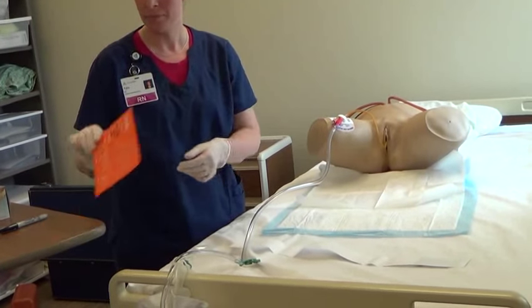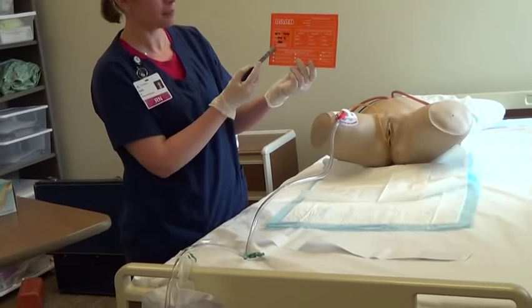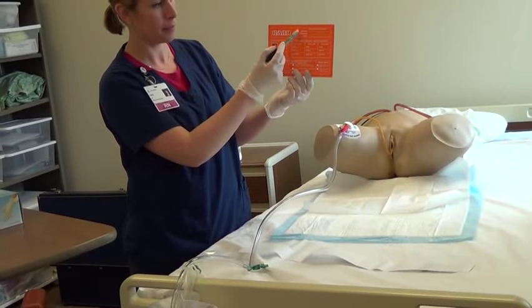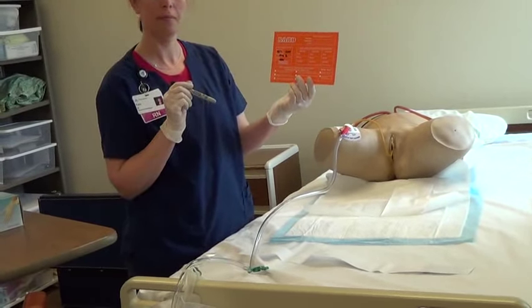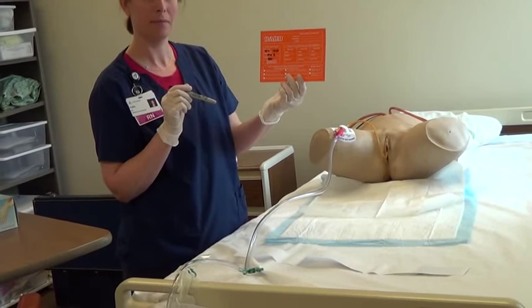Complete the orange stickers. One goes on the front of the chart, one on the front of the Foley bag, and an optional one on the graduated cylinder. This is not in our policy, but recommended by BARD. This step may be done at the very end as well.